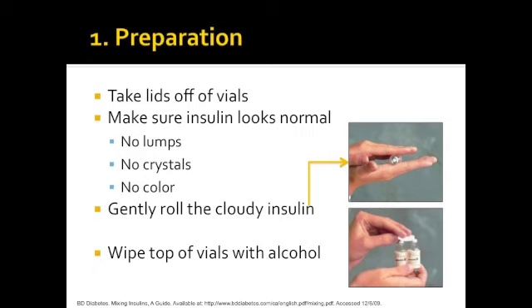Never shake the insulin instead of rolling it because shaking the bottle will make bubbles and could damage the insulin. Then use an alcohol swab to wipe off the top of both of the insulin bottles so that we know that they are clean.